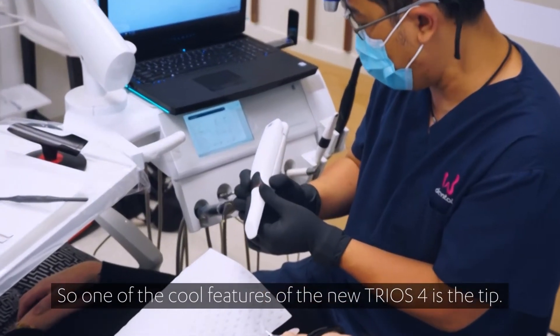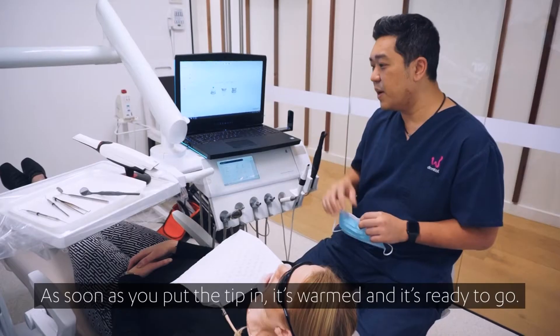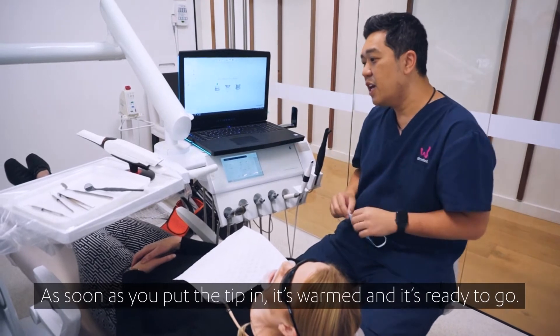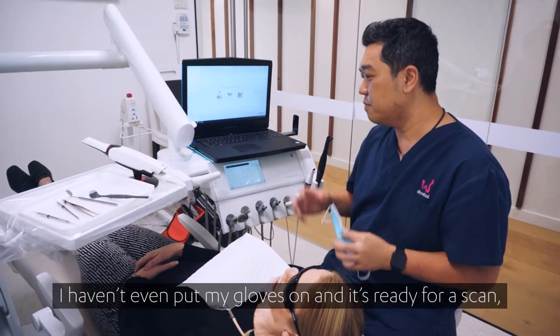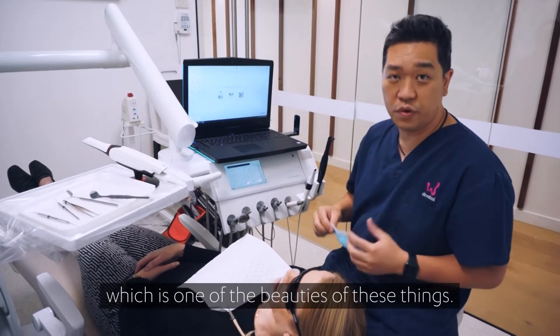One of the cool features of the new Trios 4 is the tip. As soon as you put the tip in, it's really warm and it's ready to go. I haven't even put my gloves on and it's already ready for mega scan, which is one of the beauties of these things.